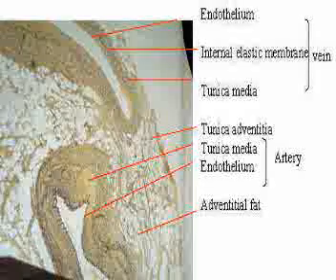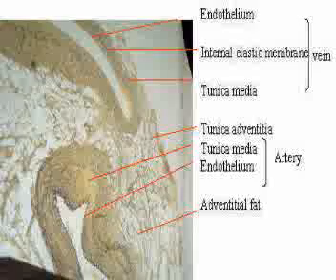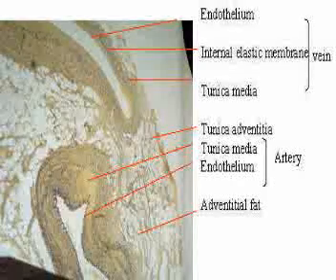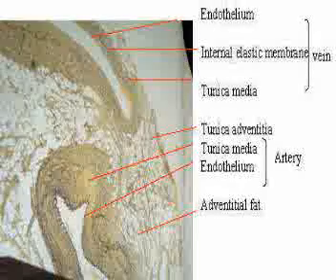Differential diagnosis. Blood vessels are small luminal organs and can be easily confused with appendix, ureter, or small bronchi. Small bronchi have similar features as trachea, and an appendix has characteristic lymphatic nodules, while vas deferens and ureters are highly muscular.